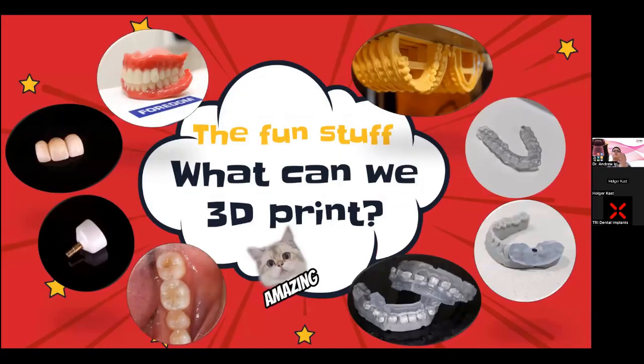So the fun stuff, what can we 3D print? First of all, we can print models, and models are so broad: models for wax-ups, clear aligner models that you can see on the top right-hand side. Lots of things that you can print when it comes to models. Models for mouth guards, retainers. It's a lot of applications.